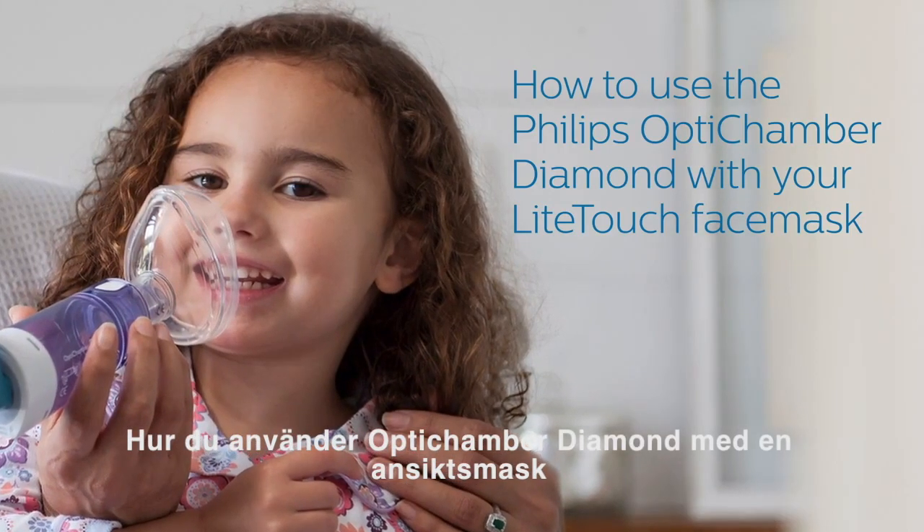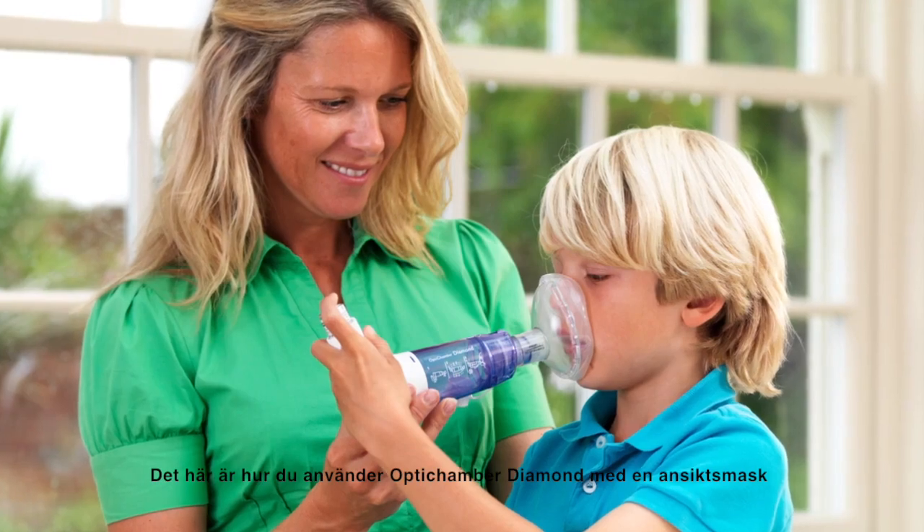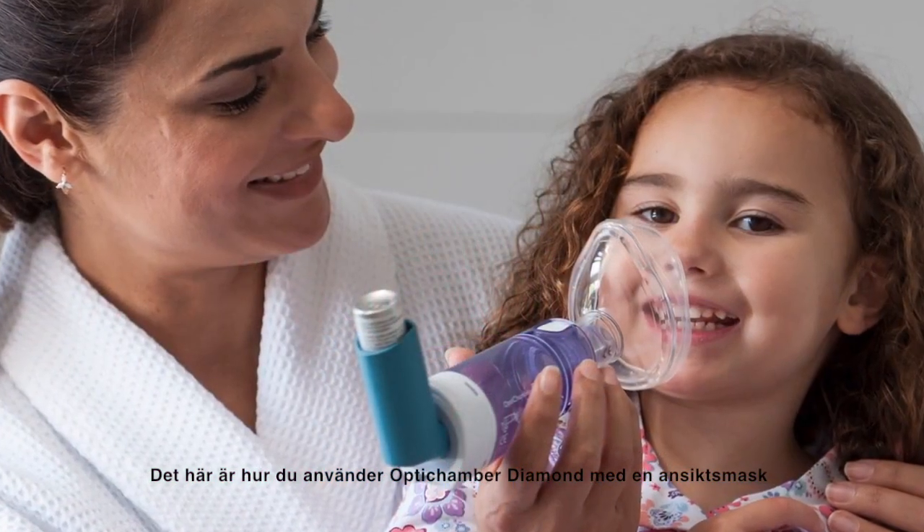Here's how to use the diamond with a face mask. The Light Touch Mask's unique soft seal gently conforms to the face with gentle pressure.